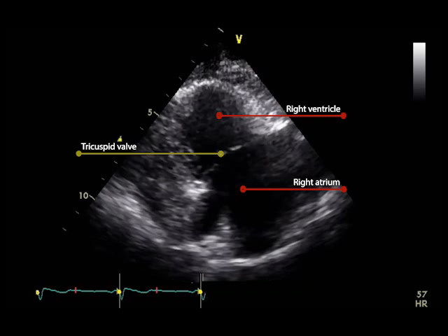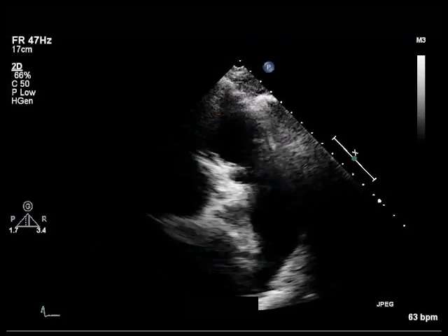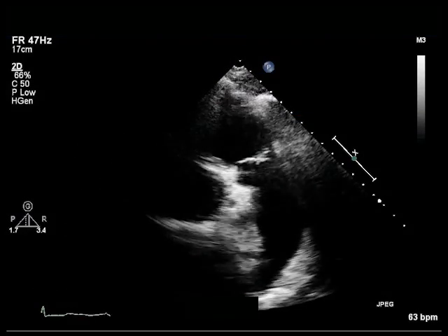It can be used for the calculation of the tricuspid regurgitant velocity in patients with an eccentric tricuspid regurgitant jet.